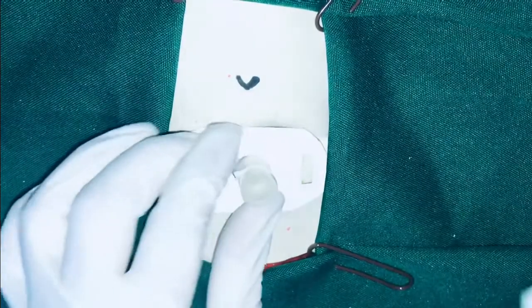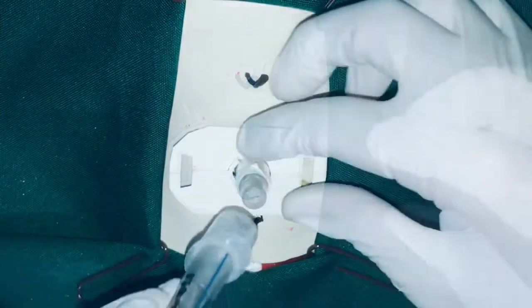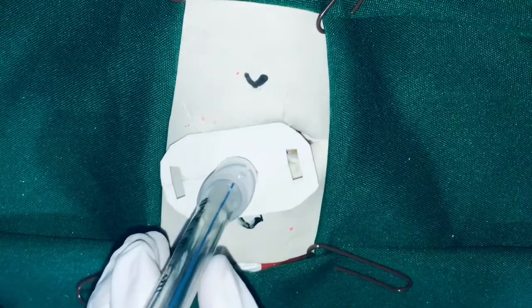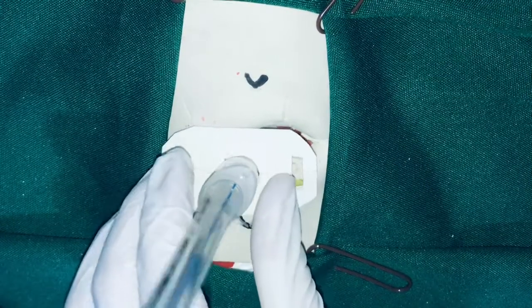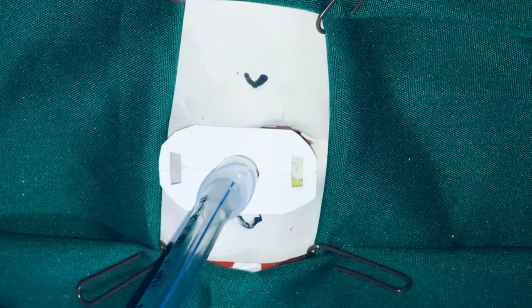The appropriate size tracheostomy tube is then inserted, the obturator is removed, and the inner cannula placed. Patient is then reconnected to the ventilator. The tracheostomy tube cuff is inflated. Confirm tracheostomy tube placement in the airway with the end-tidal CO2 level and listening for breath sounds and observing for adequate chest rise.